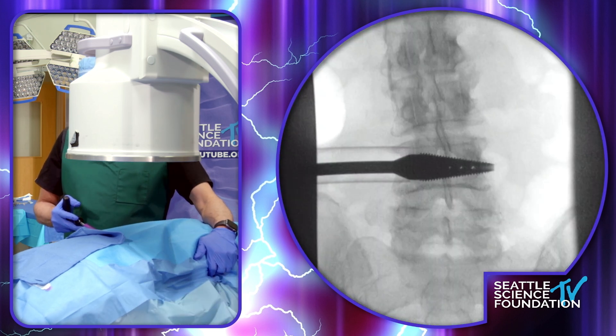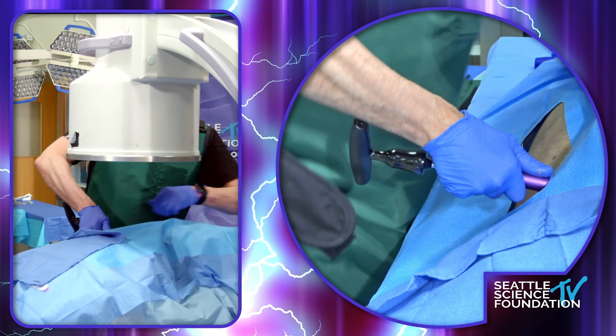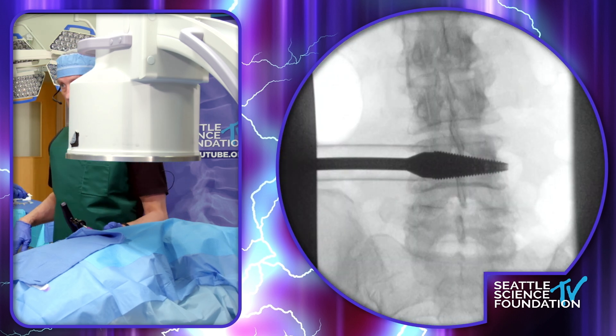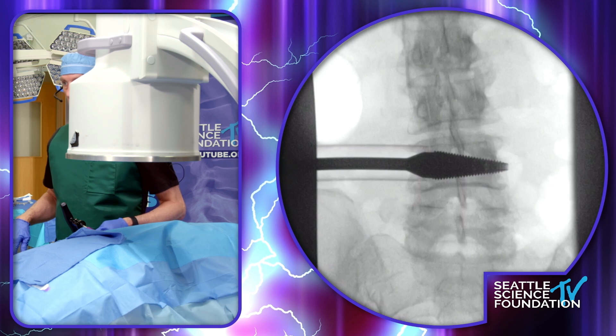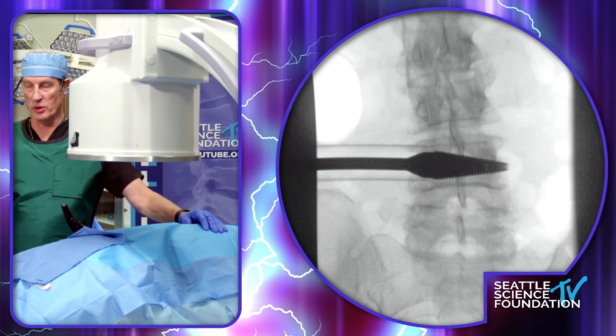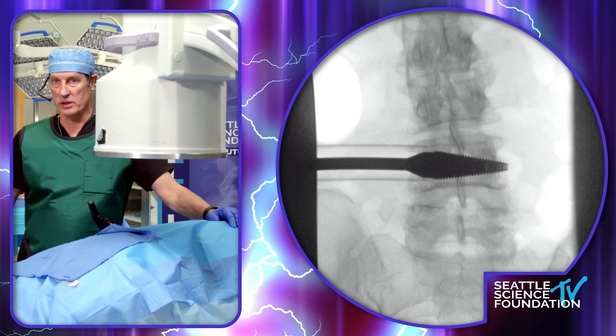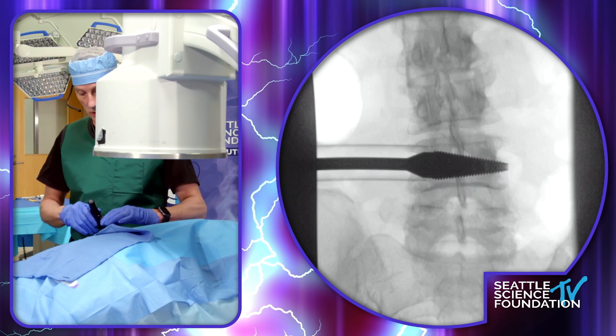This has enough force and power to be able to do that. At this point, I'm going to readvance my dilator. Does the upsizing lower the risk of spinous process fracture? You kind of do it by combination of size, patient size, and how difficult this is to put in. Cadavers are kind of off because they're frozen — they don't have the same ligamentotaxis laxity. Then there's the configuration of the anatomy: is there facet joint gapping, a little bit of spondylolisthesis, any type of segmental instability? That indicates you may need to upsize a little bit. Is it just a stable spinal stenosis? Then you'll kind of downsize. But it is by feel, too, on the ligamentotaxis.